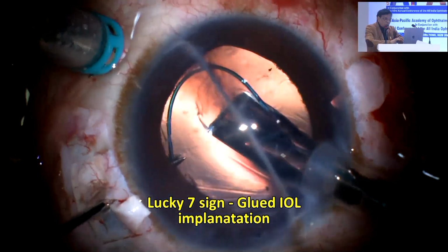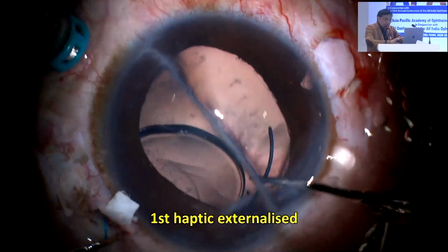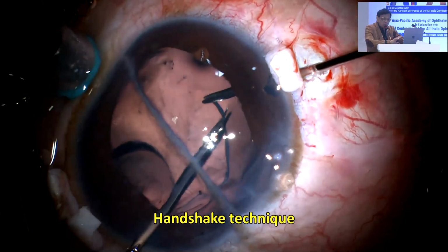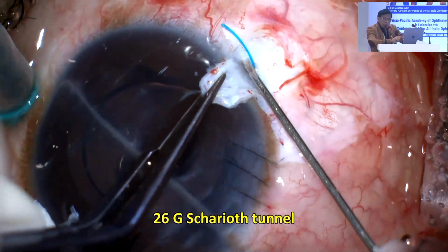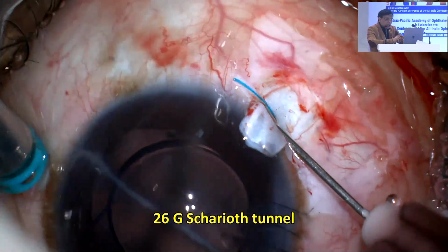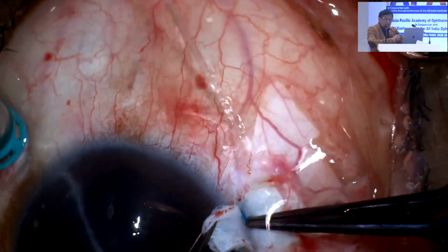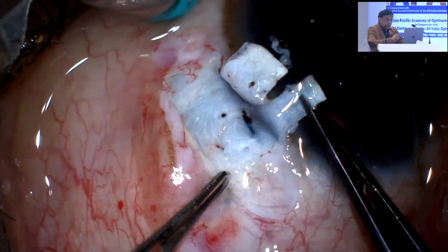And once that's done, see the haptic coming out. Once the haptic is caught, wait for it to unfold, pull it out. Now look at the handshake technique going inside. Transfer the haptic from one hand to the other, bring it out, and you can see the second haptic coming out. The issue here in this case, why I wanted to show you, is not to show only the glued IOL, but now look at the next step which I'm going to show you, and how do you manage this case, and how to avoid the penetrating keratoplasty in this case.